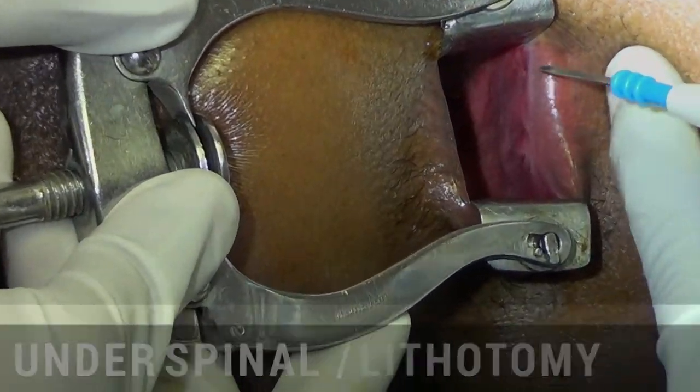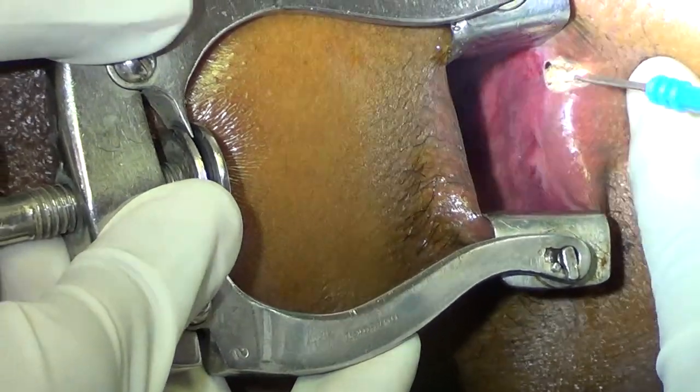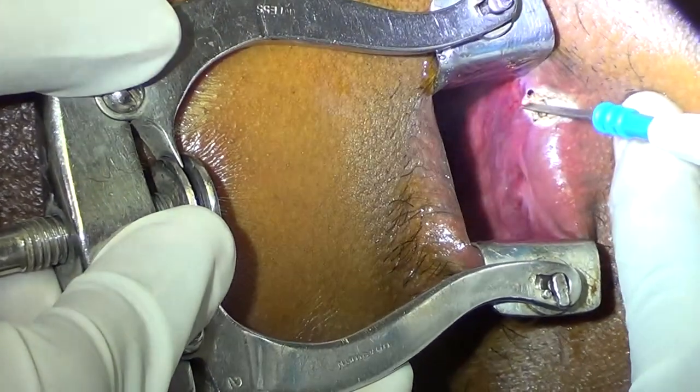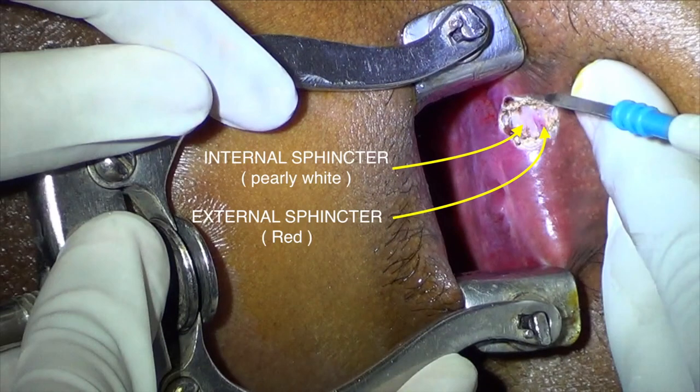Under spinal lithotomy position, we put a transverse incision of one centimeter length until you see the internal and external sphincter. The internal sphincter is pearly white in color. The external sphincter is red in color.